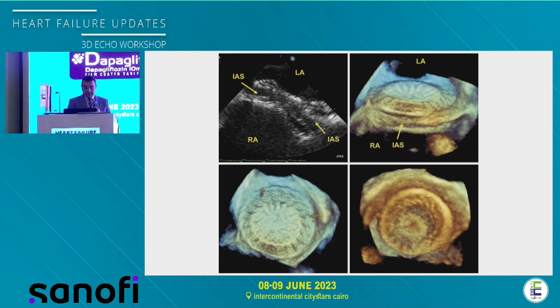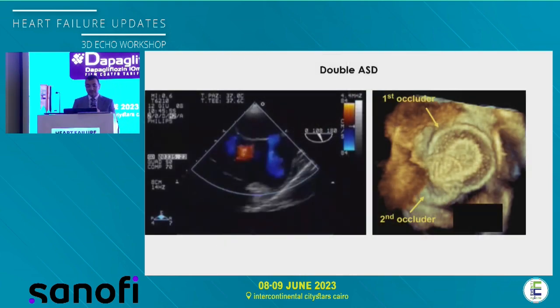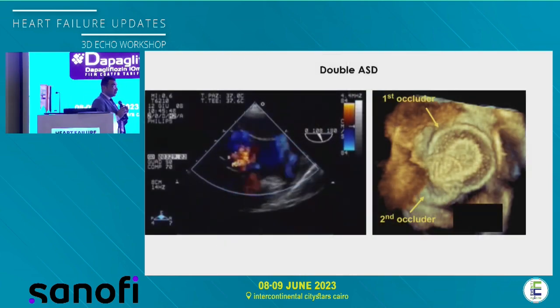These are other examples of the grasping of the interatrial septum by the 3D. I think that the image speaks for itself. It's amazing. Now, let's get to some hot topics.